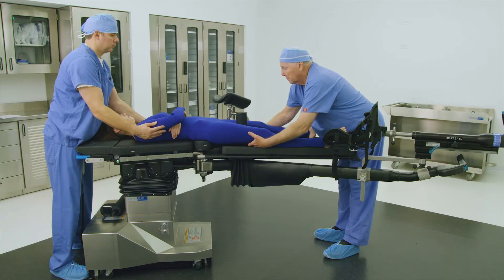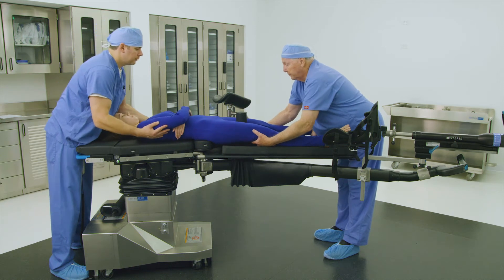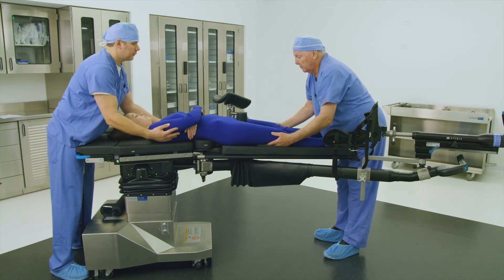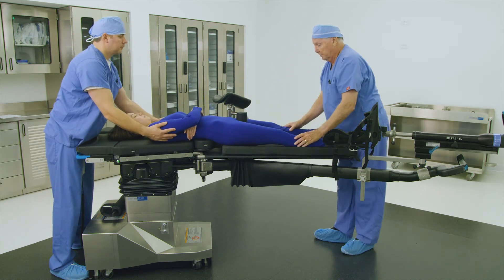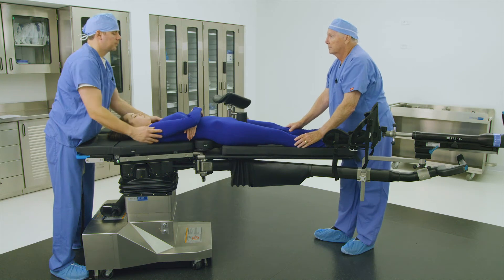Finally, shift the patient snug against the perineal post. Ensure there is no space between the patient's perineum and the perineal post.